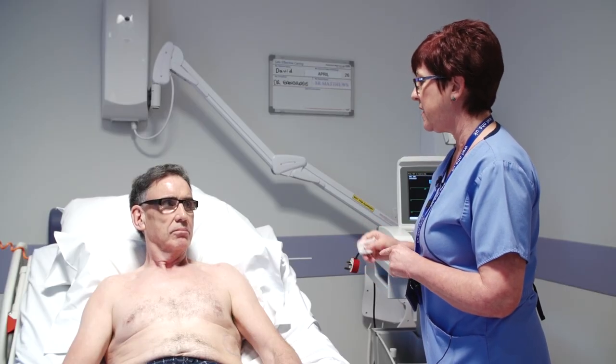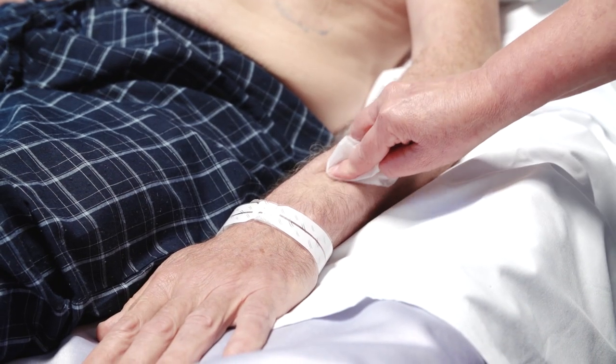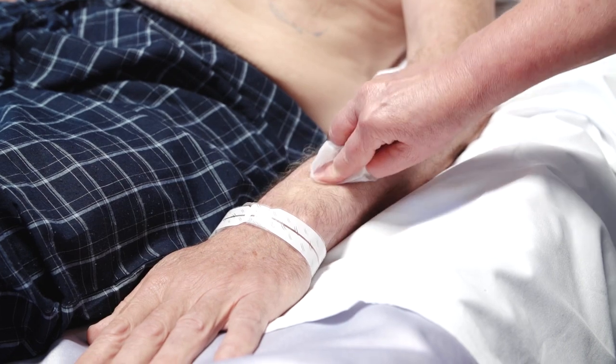Before starting the ECG, skin preparation may be required. This may involve the use of an alcohol wipe, an abrasive pad, or eraser. This is to ensure that we have a good quality ECG.